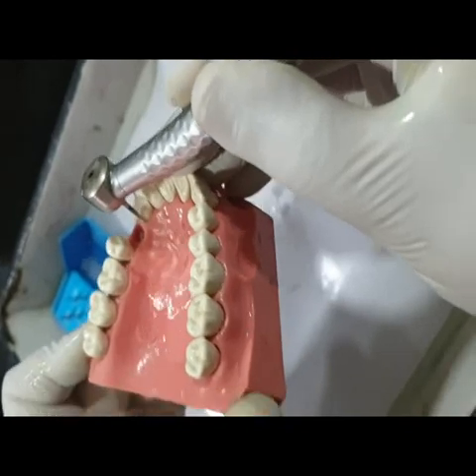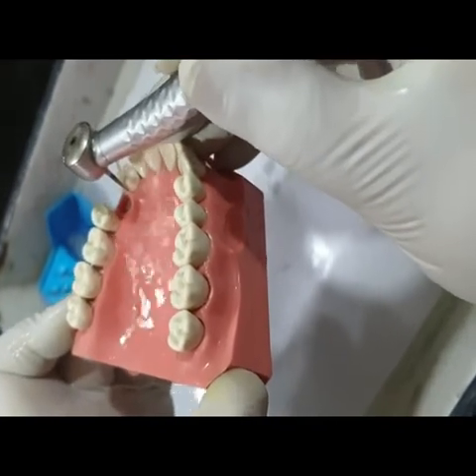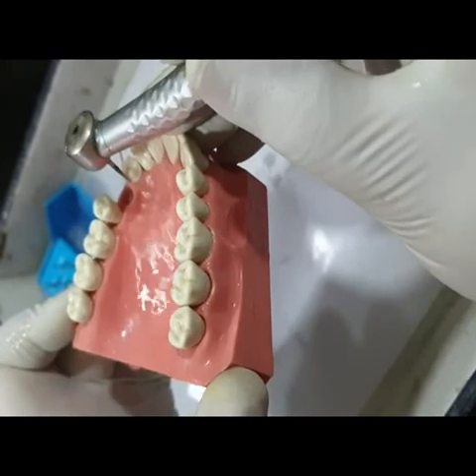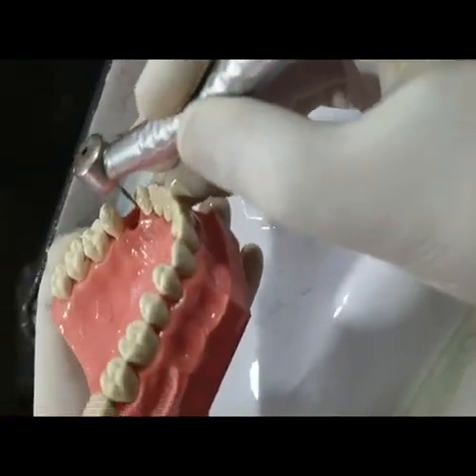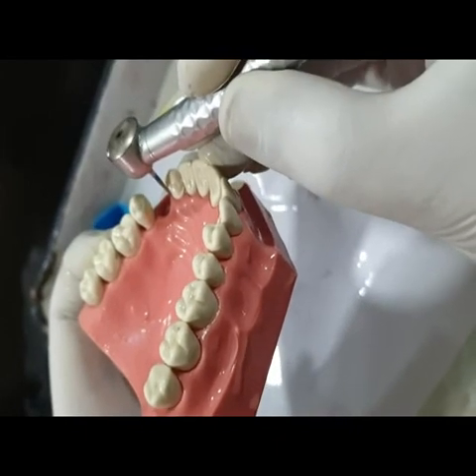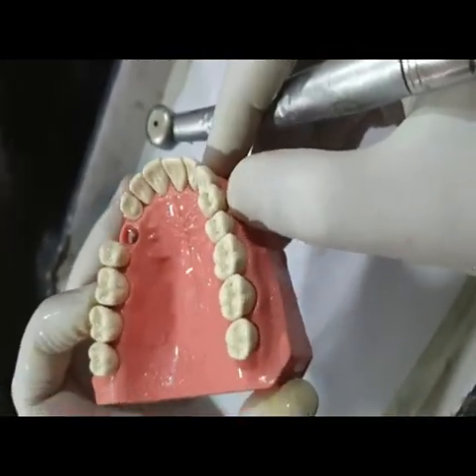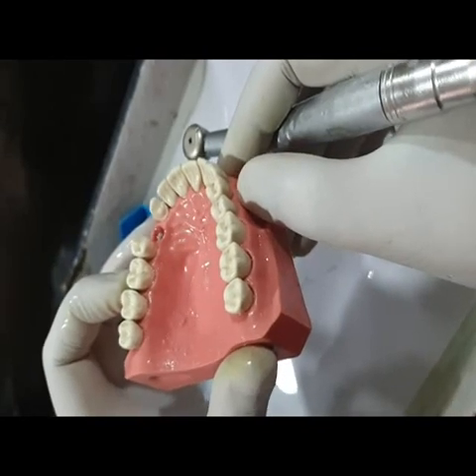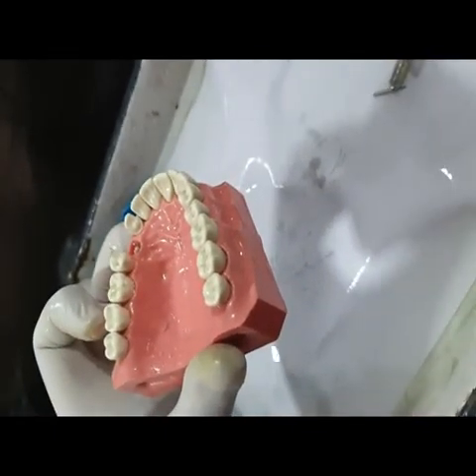As you go to the proximal side, you have to raise your bur. In the middle I bring my bur down, but as I go on the proximal side I tend to raise my bur. Stop in between to check that half the bur is inside the tooth — I have been able to achieve half the thickness bur depth inside the tooth. This is sufficient as I don't require a lot of bulk of material. You can easily appreciate the entire margin, and this margin ensures the prosthesis seats properly and avoids any secondary caries from happening under the prosthesis.